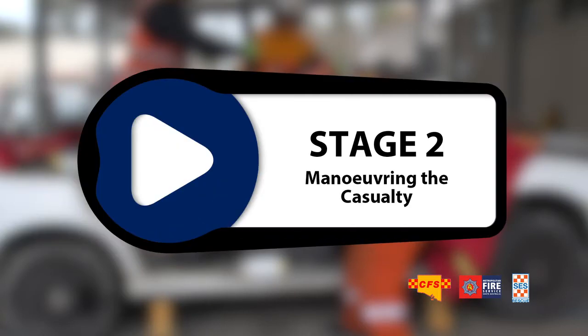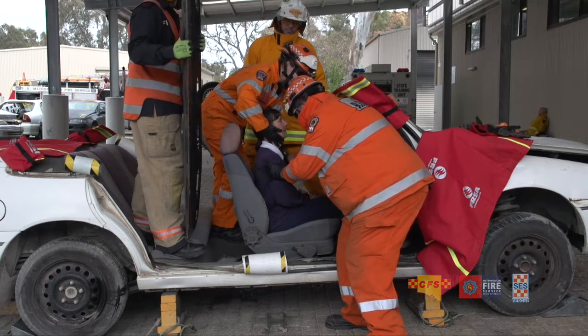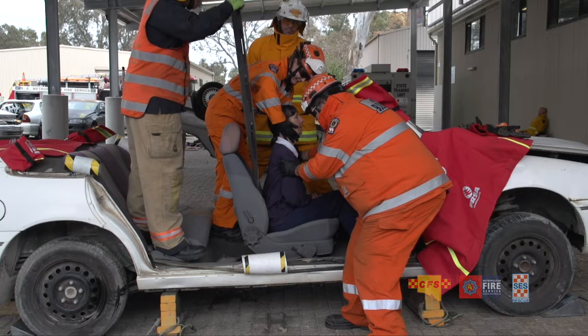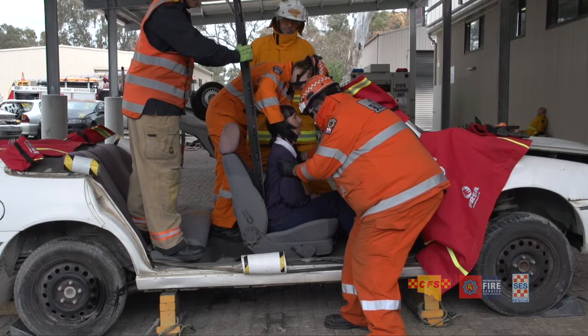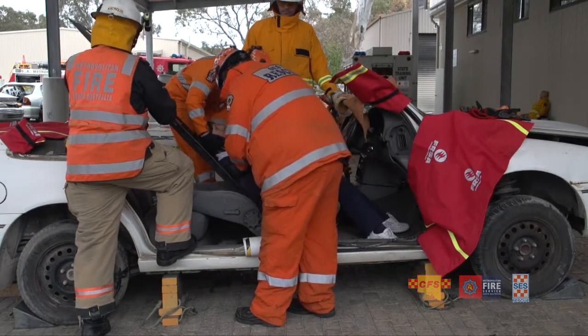Considerable neck and spinal care must be taken during the placement of the spinal board. Stage 2 is manoeuvring the casualty. A minimum of one rescuer is required to support the head and spine of the casualty prior to any movement. A second rescuer is required to have the spinal board ready to be located.